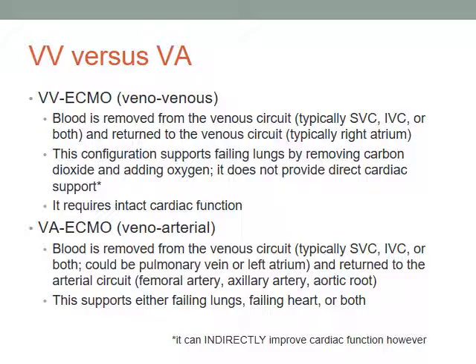It's important to recognize that that configuration will add oxygen and remove carbon dioxide, but does not provide any direct cardiac support, because you're just putting the blood right back on the right side where you took it out. If the right part or left part don't work, you haven't done anything for that. Not directly.